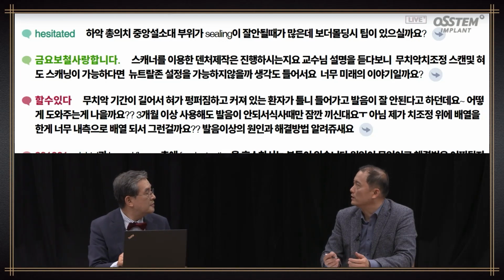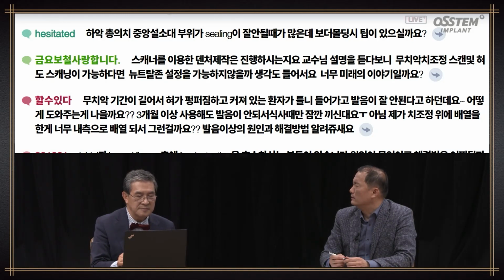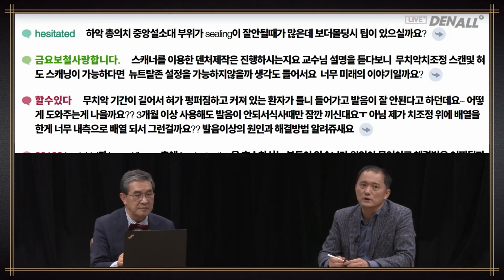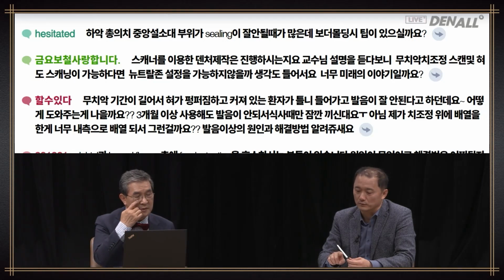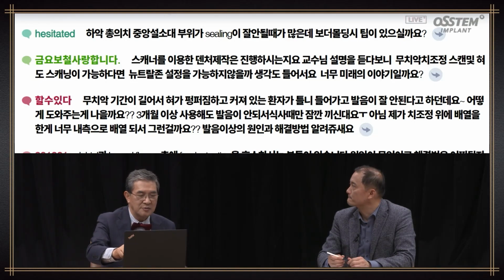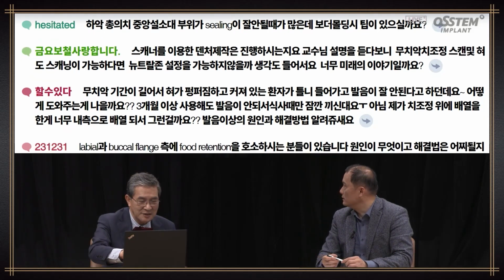Nothing really particular, but as you can see in the literature, using pronunciation, or there are different textbook approaches that you can use. And for me, actually, if it cannot seal on the anterior side, it also relates to the positioning of the tongue. So maybe improving the position of the tongue is what you need to consider. So even after making the denture, the tongue positioning through communication with the patient, or maybe having a convex or concave shape in the denture, so that the patient will draw the tongue into that area in terms of positioning. So if you have an older denture, you train the tongue and then take the impression, which could also be an option.